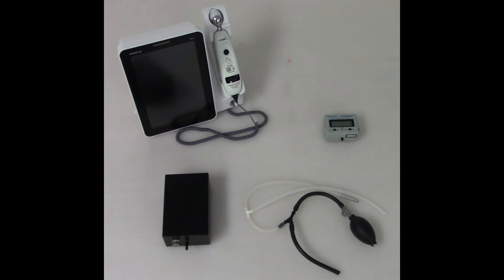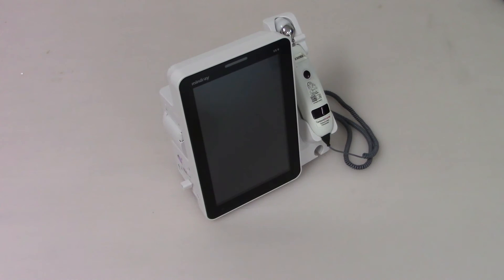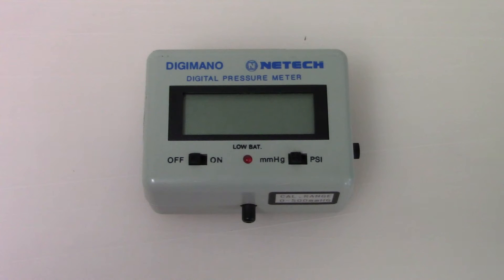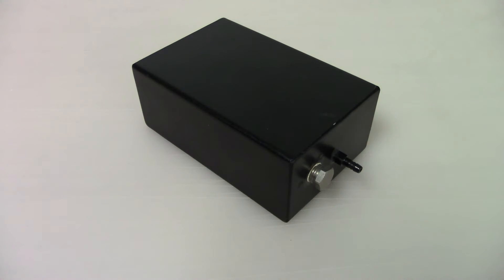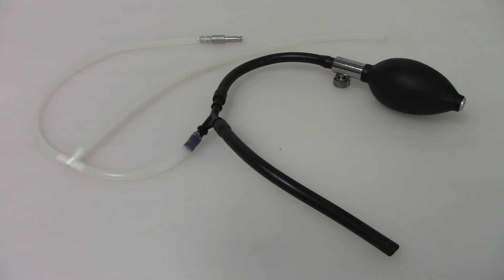The following items are required: a Mindray VS9 monitor, a manometer, a rigid vessel, and a squeeze bulb with air tubing that has an NIBP connector.